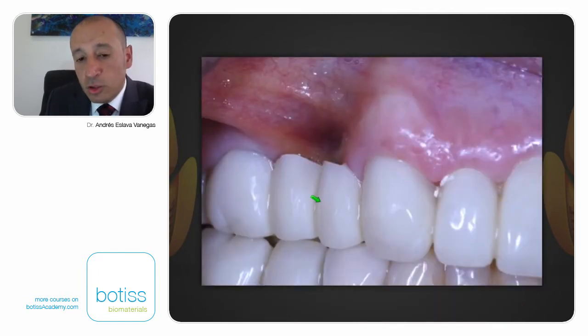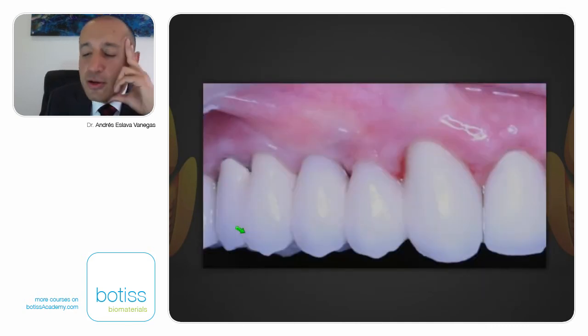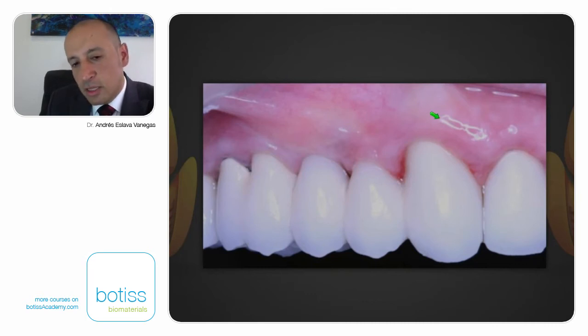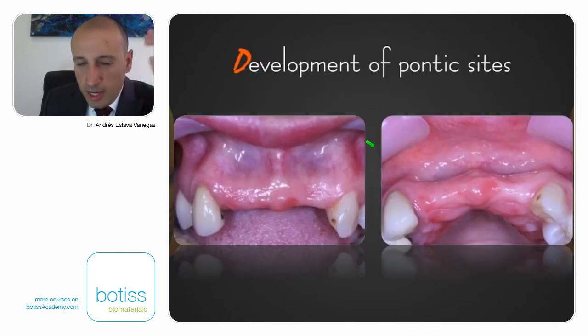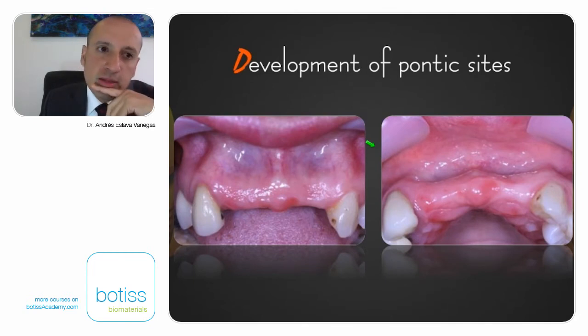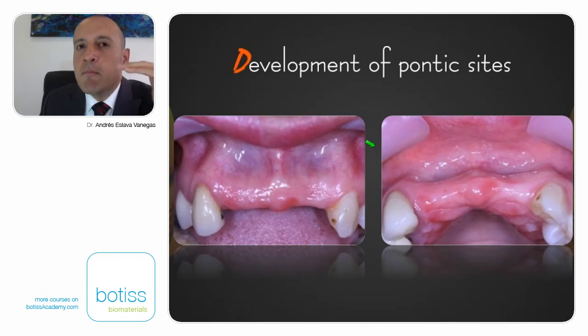Remember when we started, look at this resorption here in this ridge. But 3 years later, here's the condition of the vestibule. And look again. Look at the tissue, look at the color, look at the appearance. Look how is the biotype, and look how stable it looks like. And we started to think, okay, we can use this material. We think it could be more stable than some kinds of collagenous membranes.